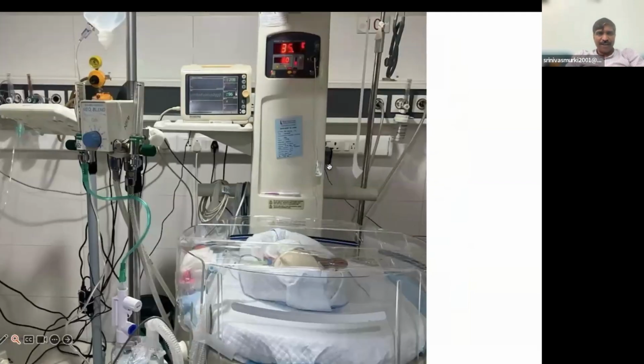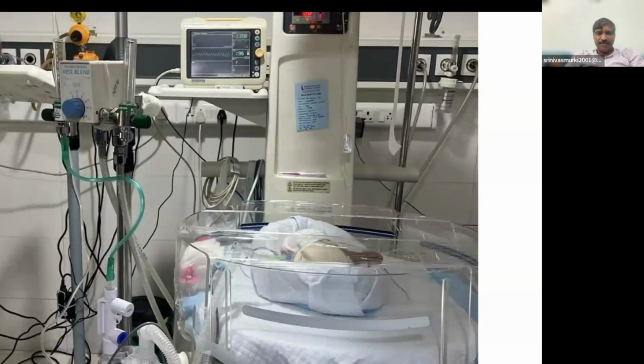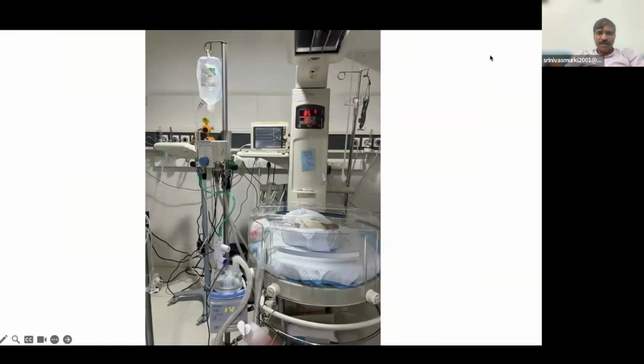Baby is hypothermic, okay? Very good. So baby is hypothermic, yeah. So temperature should be well maintained, very good. What else? What is wrong with the CPAP? Now baby can lie on the side, the neutral position. Head and body should be turned, not just the head, but the total baby is turned, so that's all right.